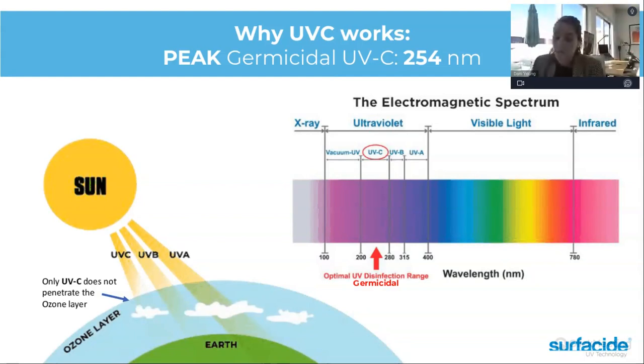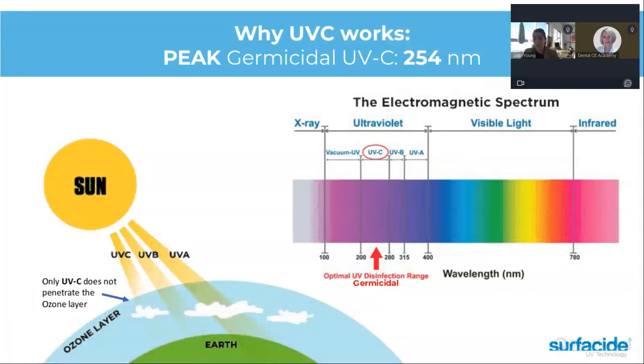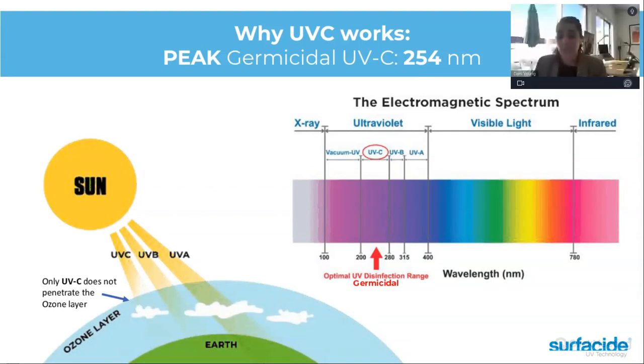OSHA protocol for UV technology, I have not seen, so I do not know the answer. I don't think that has been reviewed by OSHA yet, or at least given any protocols. Again, for the safety of an open operatory setup, it depends on the way that you want to use the technology and the operatory specific setup.